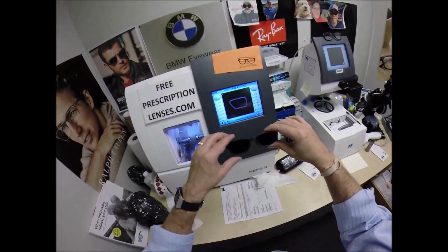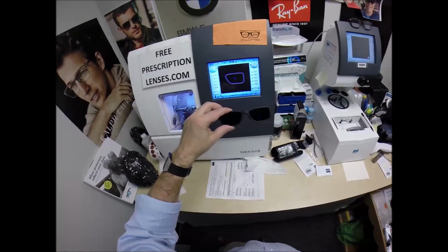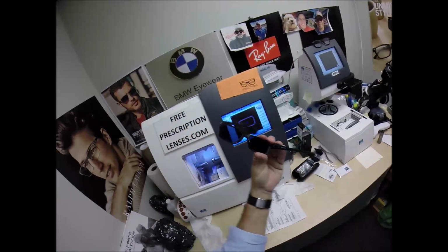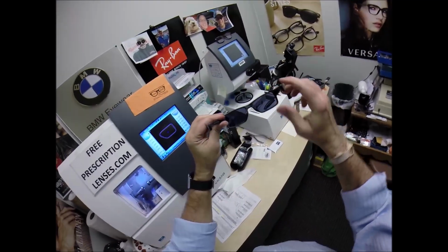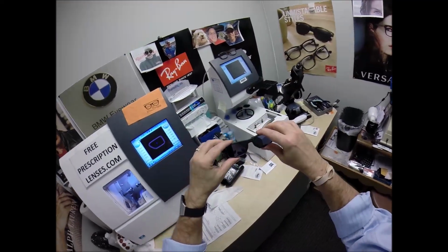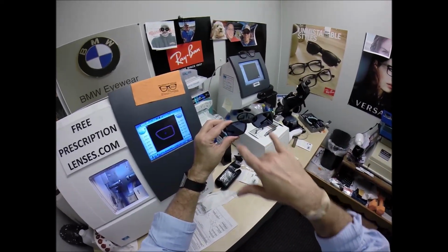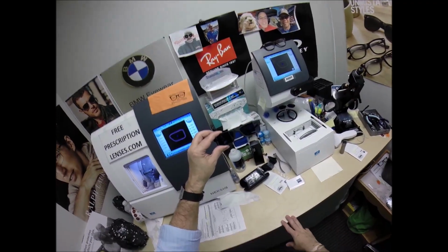The only time the Zeiss PhotoFusion and Transitions 7 and 8 don't work is if you're behind the windshield of a car. Your windshield absorbs the sun's harmful ultraviolet rays that would cause your dashboard to crack from sitting in the sun all day, and that's why they don't turn dark in a car. Having said that, Essilor Transitions Extra Active and the PhotoFusion Extra in gray from Zeiss will turn 30 to 50% dark behind a windshield.